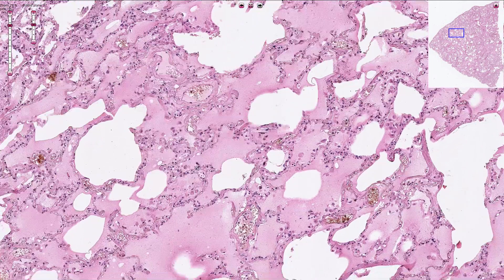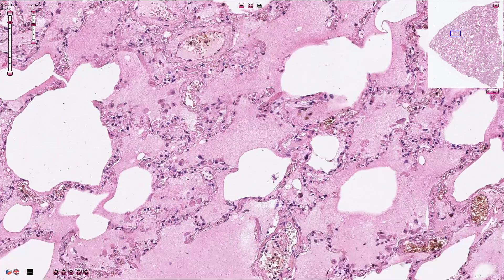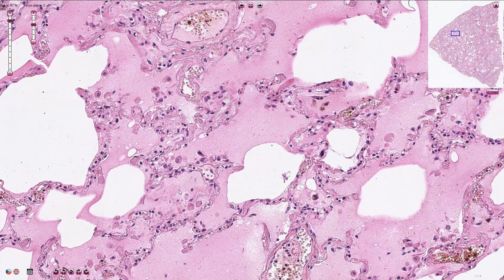Inside of the inter-alveolar septi we can appreciate small capillaries with erythrocytes, endothelial cells, and alveoli are lined by pneumocytes. Here we can see the edematous fluid, and inside of the alveoli we can also find macrophages.